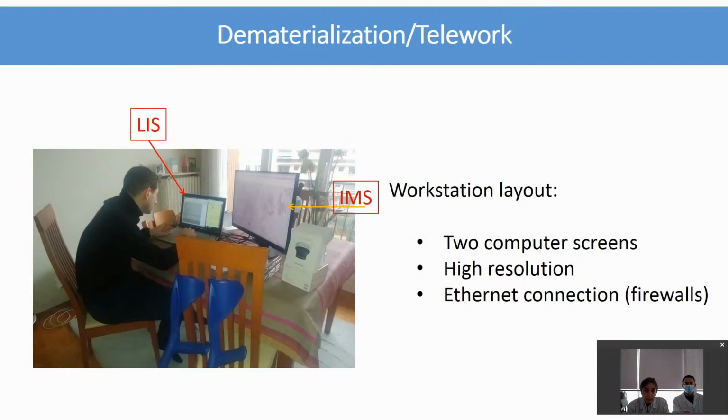In the same line, another challenge has taken on great importance with the regrouping of pathology structures and even more in this period of COVID pandemics: the dematerialization of pathology. Clovis tested it last winter because of a skiing accident, as you can see. Thanks to digital pathology, he was able to work at home instead of being off 1 month and a half. This needed, of course, high-tech installation at home.